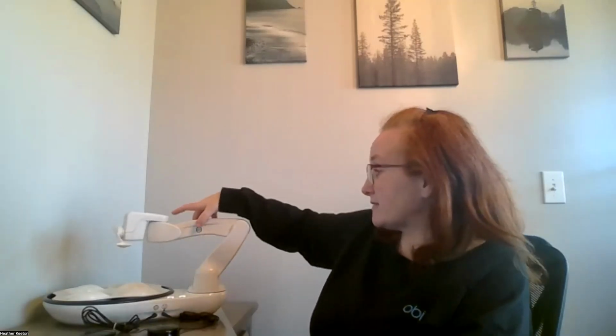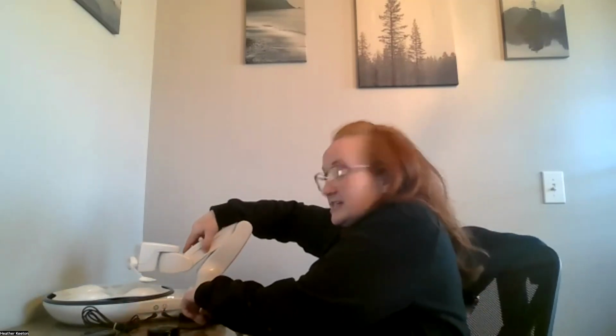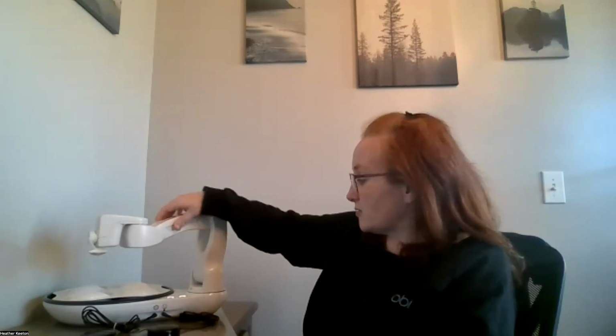So what happens if you grab it and you're not ready for the weight? It does this. If it does this, and the teach is flashing and it's shaking its head, that's Obi telling you, I can't deliver there. Just pick it up and move it where you want it. But the main thing is keep your finger over this button the whole time, because as soon as you let go of that button, the motors lock. Okay, so repress teach, and it will nod, yes, I have that.